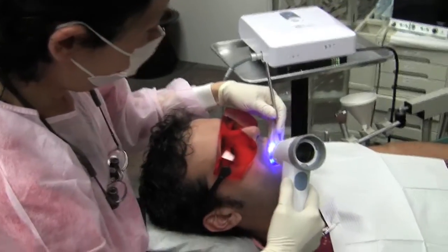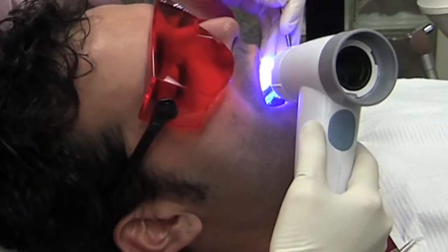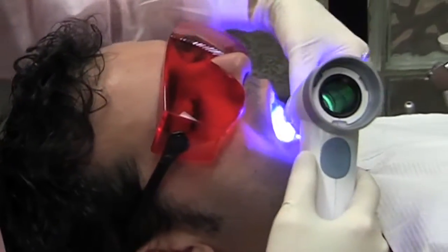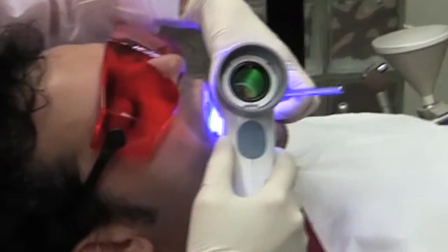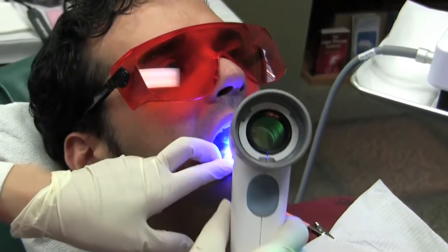We are doing a Valscope cancer screening exam. We use the fluorescence light to detect any soft tissue that appears to be abnormal. With Valscope, you actually use this blue fluorescence technology.